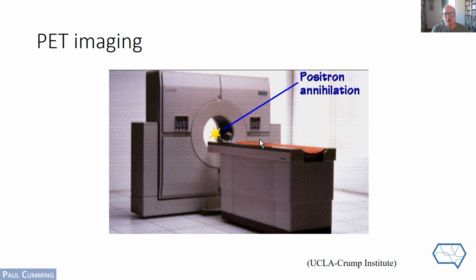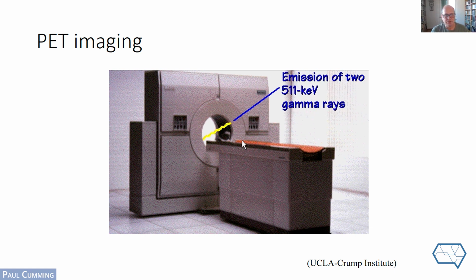Because each pair of detectors separated across that detector ring have to be wired to each other so that synchronous events of gamma detection can be registered. Next slide, or forward. Sorry about the clicking noise. So here you see again, the emission of two gamma rays at nearly 180 degrees. Ahead, next slide.